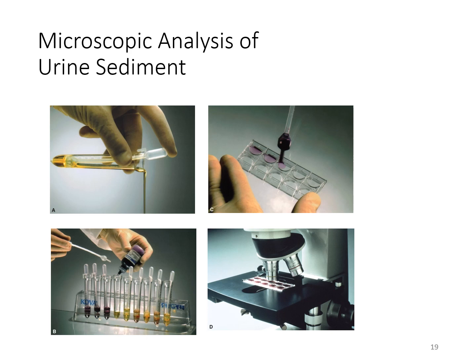So here you can see the urine was placed into a tube, it was spun down, and then it's being poured off to leave about 1 ml at the bottom. You can see that in picture A and picture B directly under it. This person is adding a dye reagent to each of the tubes so that they can observe certain elements a little bit better. A lot of times this is just preference. A lot of people don't like to use the dye, some people do, so it's just preference as to whether or not you want to use it.